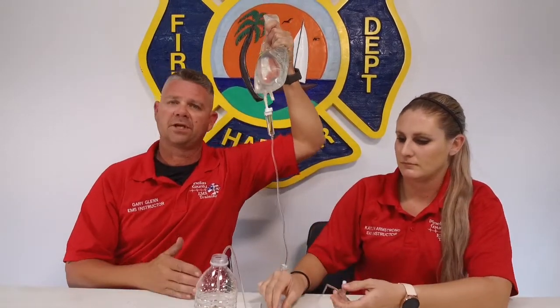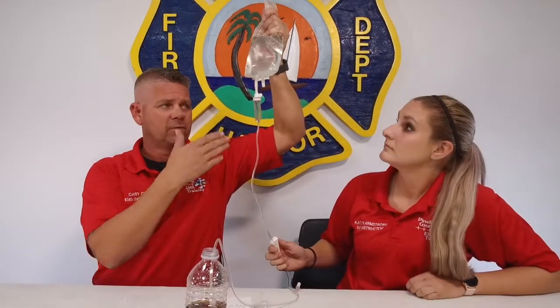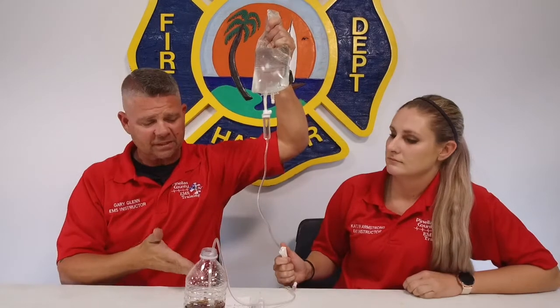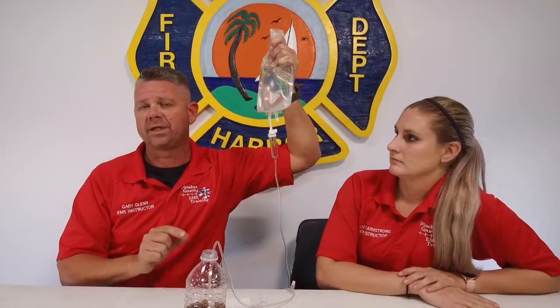But what do we want with this medication? We want that medication to get into the body as fast as possible. So our drip chamber filled up and the medication kind of backflowed a little bit. So this may be that one time where we need to actually pinch the line to give a medication and then open it back up and allow for that fluid to flow through. So I guess this myth would be plausible or busted? What do you think? Plausible. Plausible. All right, so this one's plausible.